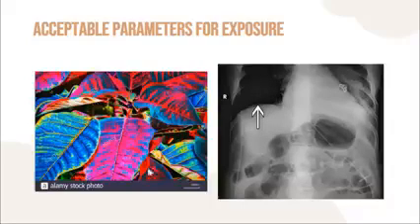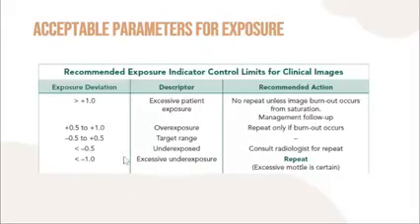If it is a normal picture such as this one, you have many colors. This one has too much of a short scale contrast, so you cannot differentiate the bone, the lung markings, and the other areas. That is for when it is over the upper margin.